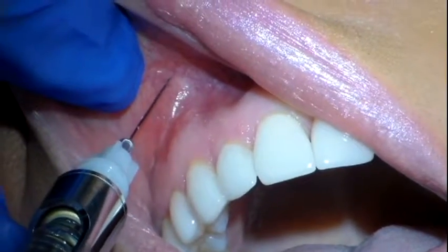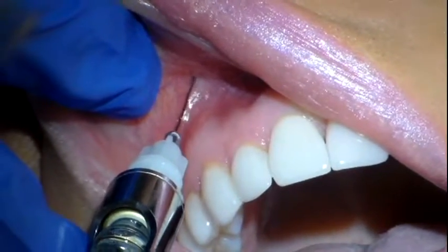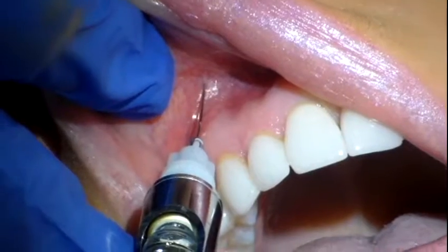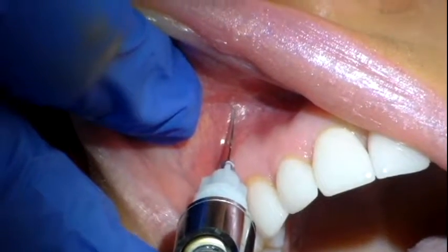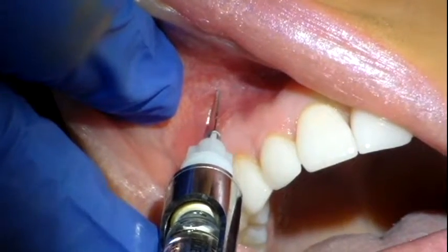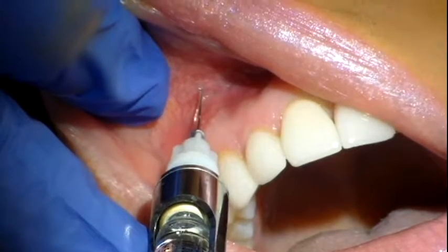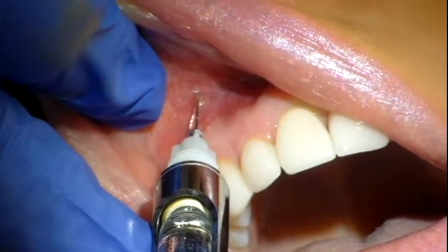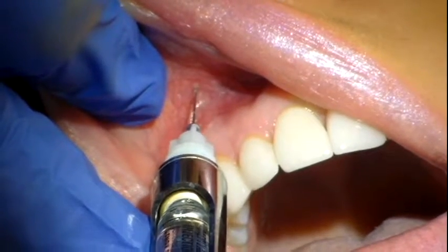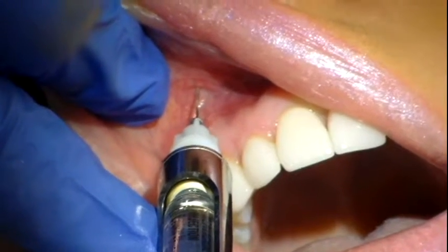I'm going in and matching the slope. I'm out about three to four millimeters from the bone and I'm going to penetrate. Just cover the bevel. I'm going to aspirate — it's negative. I'm going to deposit some comfort drops, wait five seconds, then proceed in. Now I'm at site. I felt contact, felt resistance, so I backed off about a millimeter. I'm going to aspirate — it's negative. I'm going to deposit just a few drops, wait five seconds, and now I'm going to begin depositing and withdraw.